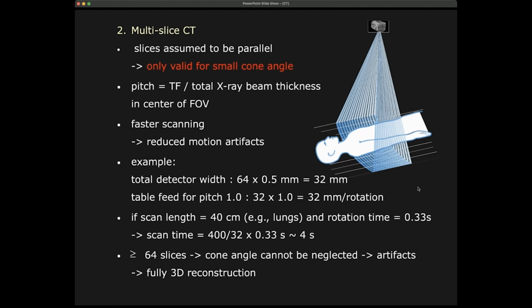Of course, the big advantage of this is that you can scan much, much faster, so your scan time becomes a lot shorter. The other thing is that every X-ray is being used, so you don't have overlap of X-rays. That means that you can actually reduce your dose. So you don't need to scan different parts in a different way, and even if my X-ray field is non-ideal, that isn't too much of a problem.